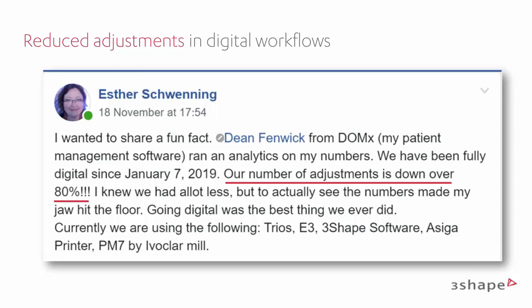And Esther is a denturist in Canada. She is so happy. You can also see what she says here: going digital was the best thing we ever did. She will also be presenting in Chicago if you are coming there, if you want to learn more about her experience. But really, really positive feedback.